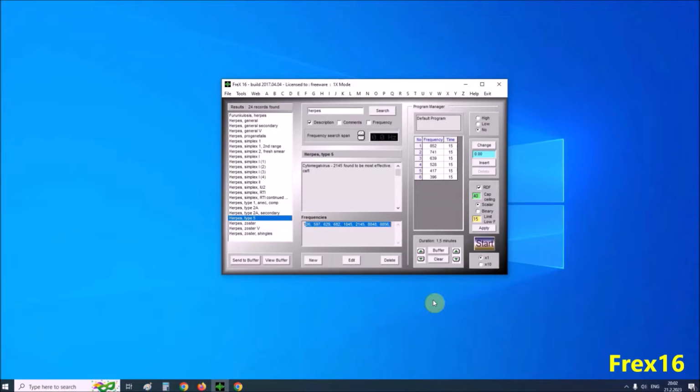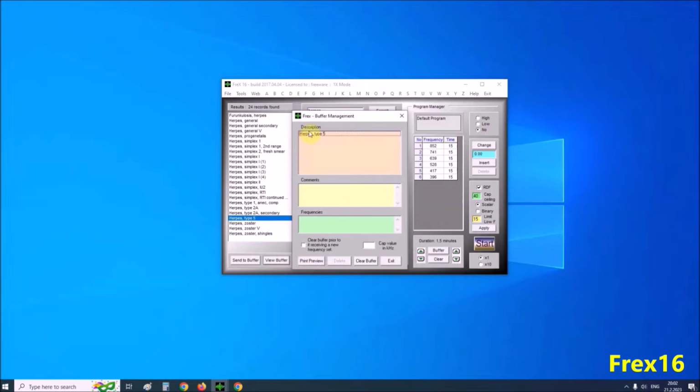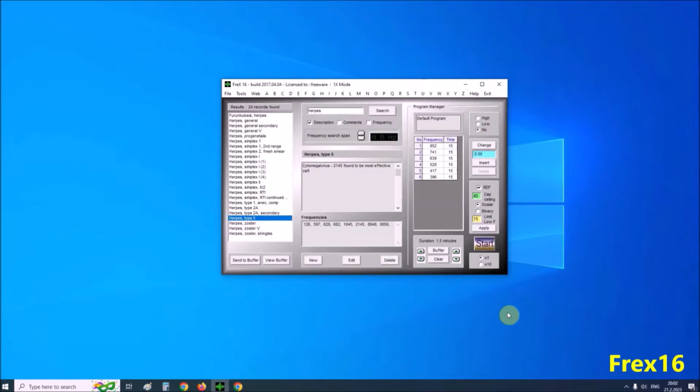Now we set these frequencies to the buffer, then view the buffer and select herpes type 5. Exit. Next we clear the previous buffer, so this is the previous buffer, and enter the new one. Here are the frequencies, and here are the durations of each individual frequency.